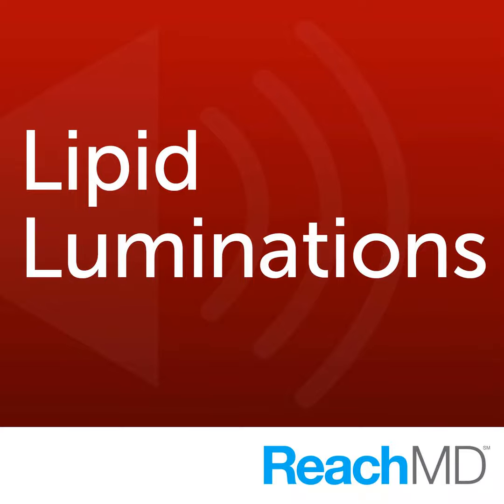But in this particular case, there was no difference, but the major flaw was that the starting carotid IMT thickness was pretty low, like 0.7, which, if you had to pick a cut point for carotid IMT for what's normal and what's abnormal, and we talked about how you can't really do that because you have to normalize for age, gender, etc., 0.7 would be a good cutoff. So essentially we started with normal carotid IMT and we showed that we couldn't make it any better.